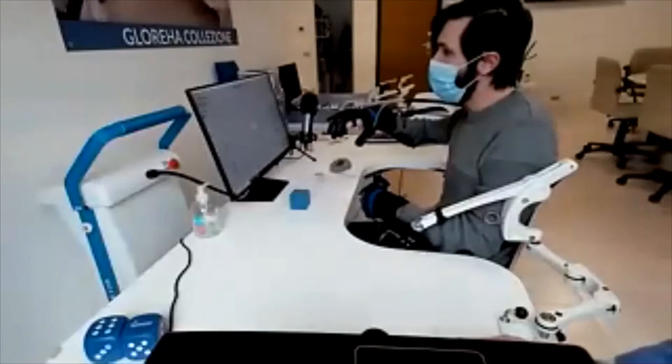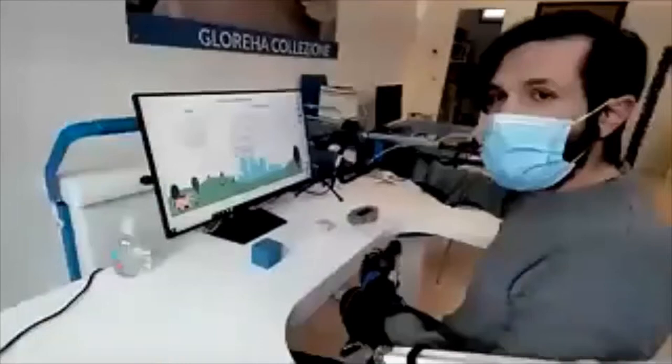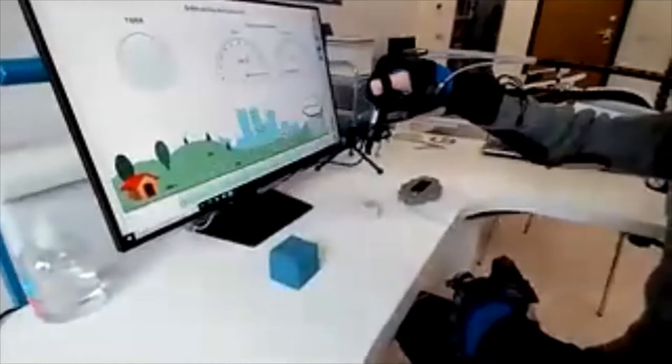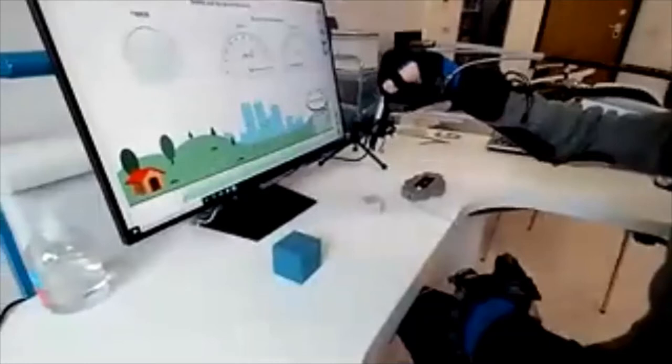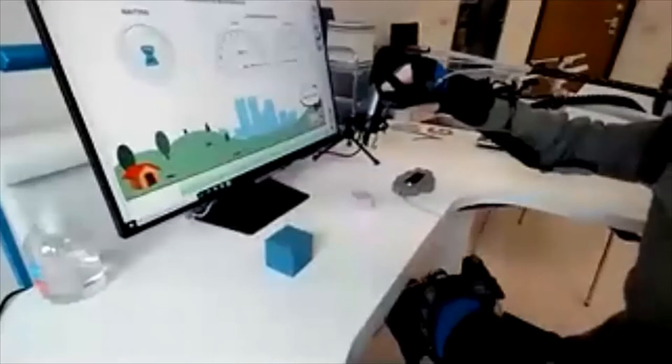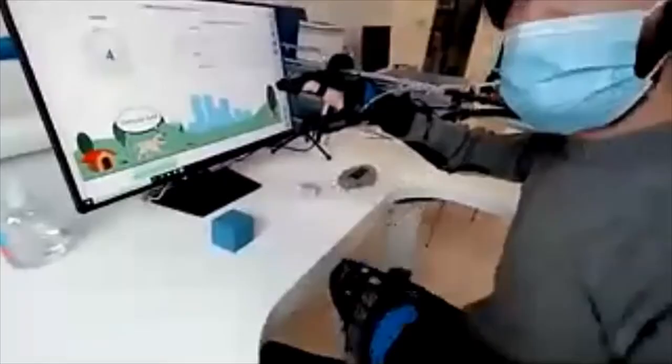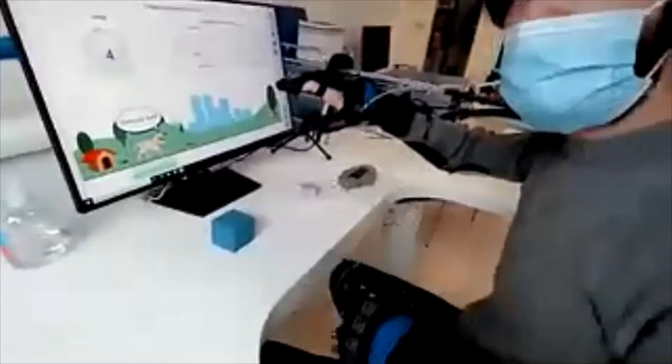Let's start with the active therapy. As you can see, it's a pretty simple exercise based on text instructions. The patient is asked to open their fingers, and then open the hand again — this is how the patient performs the movement following on-screen guidance.